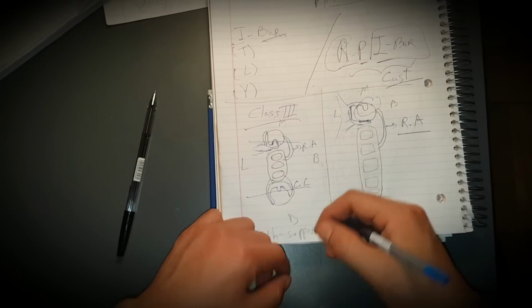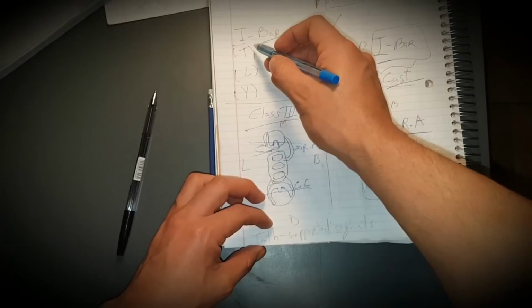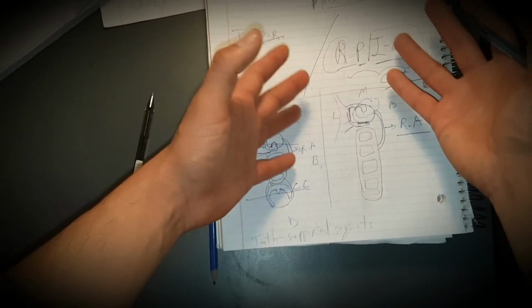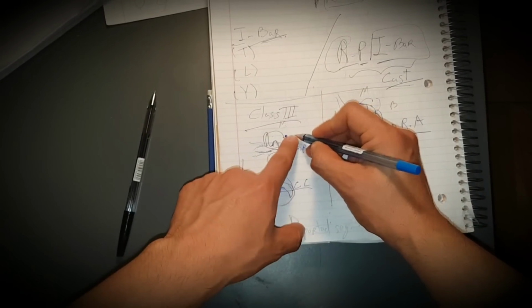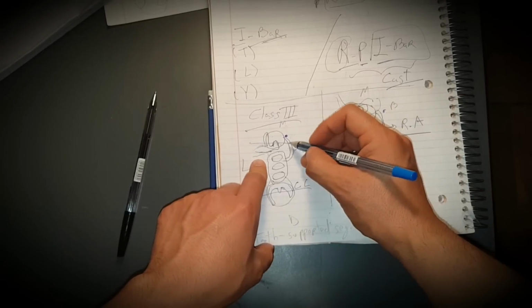Perfect. Now, which undercut does it engage? Either the I bar or the RPI, because it's the same, just the retentive arm. It's usually going to engage the mid buccal, but it can also engage the distal buccal.